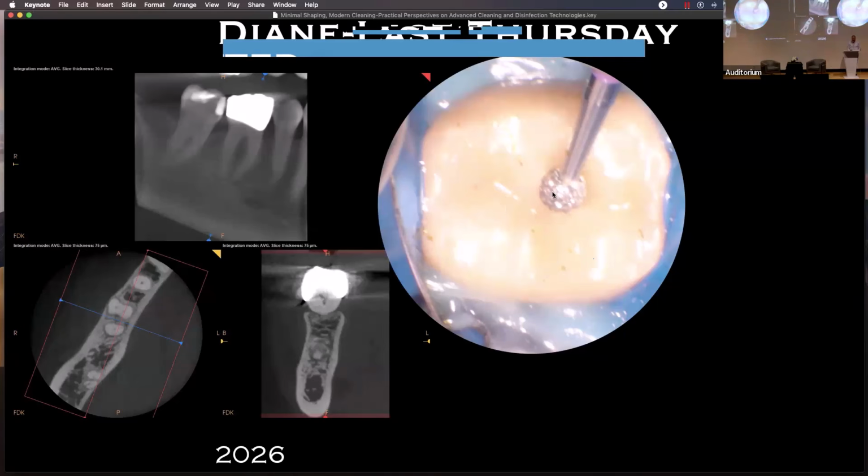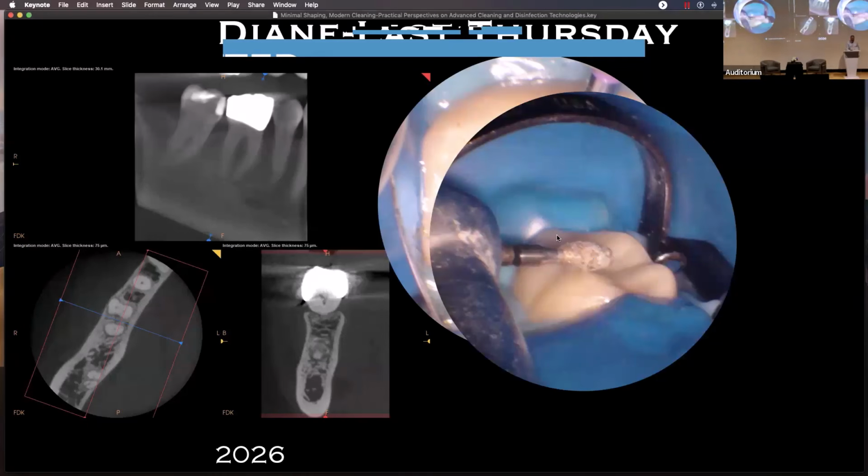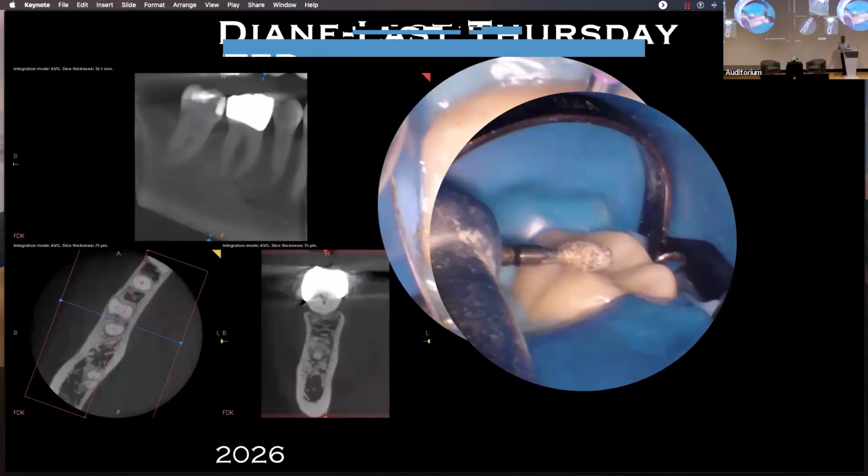And I've got these zirconia diamonds here, but almost always, if you look closely in the microscope, you can see wear facets of these crowns that I think contribute to the pulp dying in these case types. And the first thing I'm going to do is get a football diamond in and knock off some of those wear facets. And if you've got wear facets in zirconia, you really got wear facets. So that's the temptation. So we're going to do that.